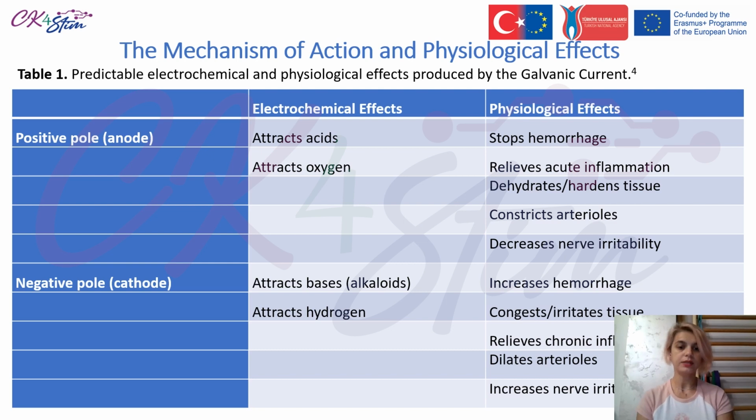So the smaller one acts as the active pad, usually not exceeding half the size of the larger dispersive electrode. Under the milliamp rule, users keep the amperage density within 1 milliampere per square inch of the active electrode area.